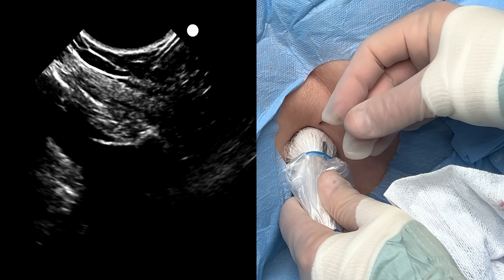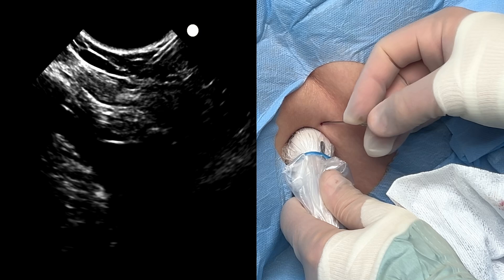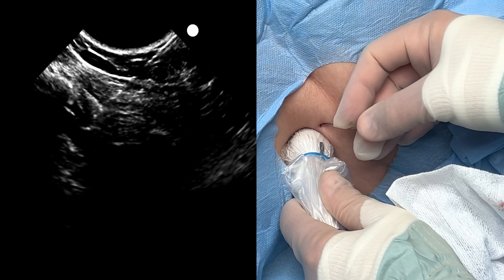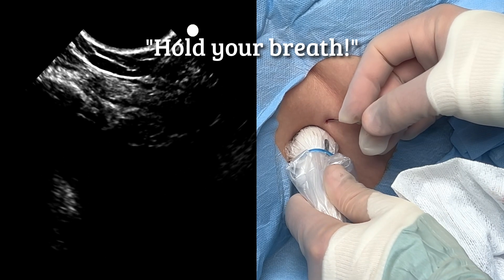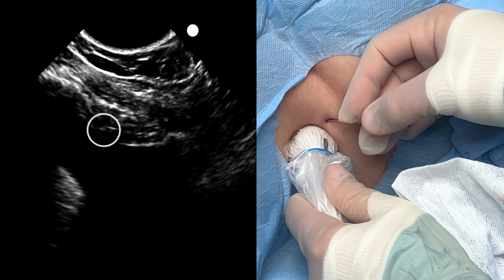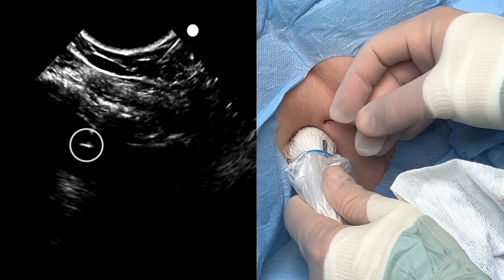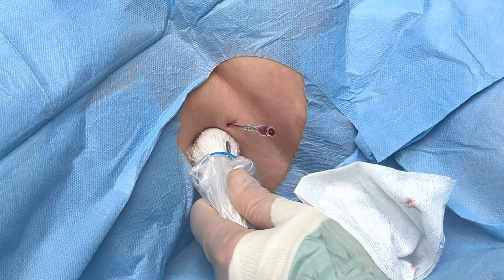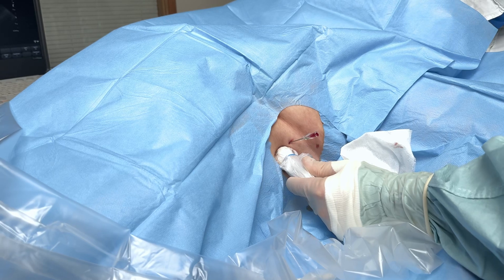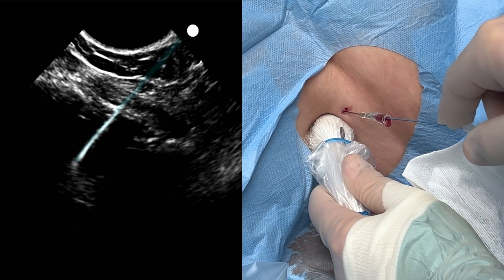Switch to the steel cannula. Place your thumb over the hub and follow the planned trajectory. Make a brief pause when the tip reaches the pleura and assess the ultrasound image through the patient's breathing cycle. Note how the position of the lung and the diaphragm shift. Sometimes you may have to ask the patient to hold their breath at the point in the breathing cycle when conditions are optimal. The puncture should be decisive enough to penetrate the pleura, but not too deep, as you risk hitting the diaphragm or the lung. Visually confirm the needle tip in the pleural effusion — here, once again, in slow motion. Pleural fluid will usually start dripping out, but occasionally small amounts of air may be sucked in. At this point, do not put down the probe, as the tissue rebound may dislodge the cannula. Have the guide wire ready and insert it under real-time ultrasound guidance. It should pass freely and you should see it descend along the diaphragm.